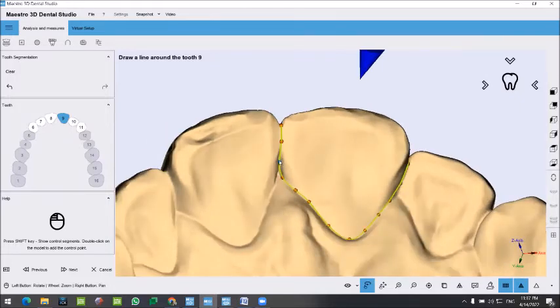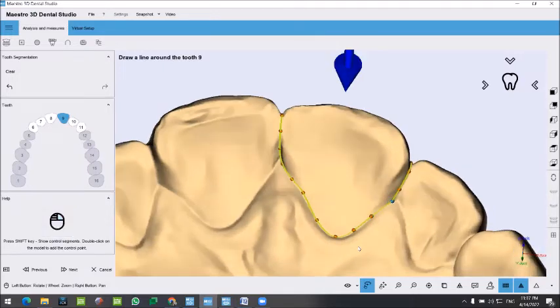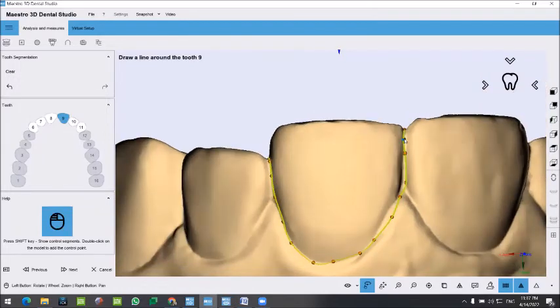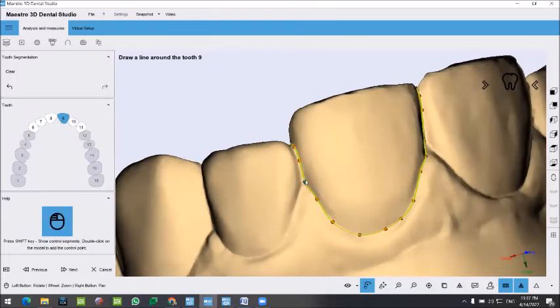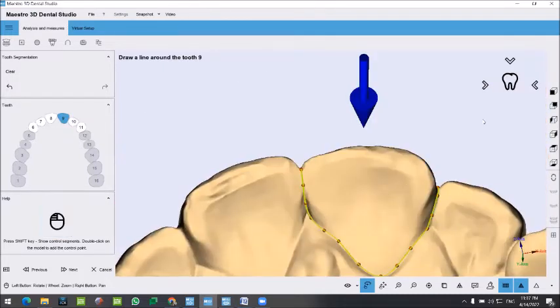To be honest, there is no evidence to actually say that we can correct these skeletal defects using aligners. However, we can incorporate the movements or the treatment with other modalities. For example, we can use mini screws, or what we call TADs, to have elastics to do some traction in specific teeth, a specific quadrant, to try to correct skeletal defects. However, there is no evidence that we can do so.